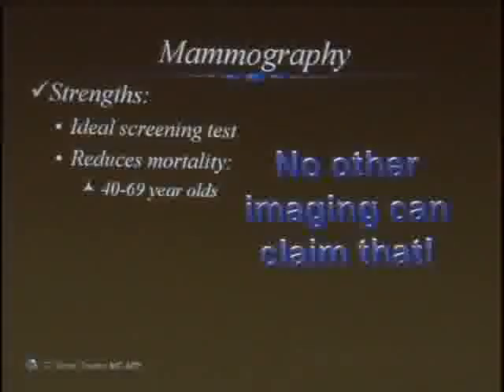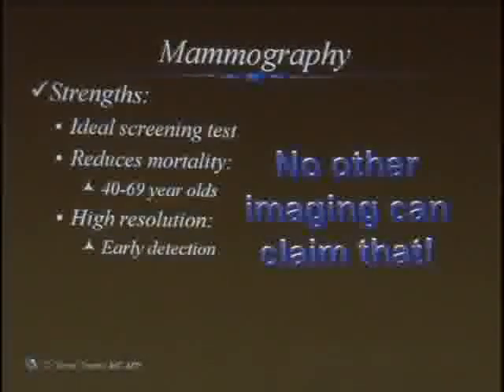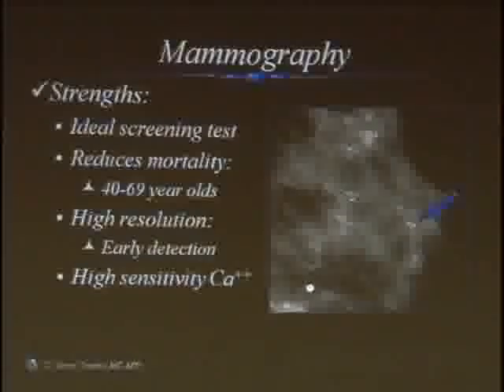The test is an enormously powerful test that's supported by an even larger, enormous body of data. This is indisputable in all of the world's medicine and medical literature. It's very high resolution, which is what you need in a screening test to detect something bad early. It has very high sensitivity to these little white dots, which are calcium. These white dots have a different meaning than that white dot to a trained radiologist.